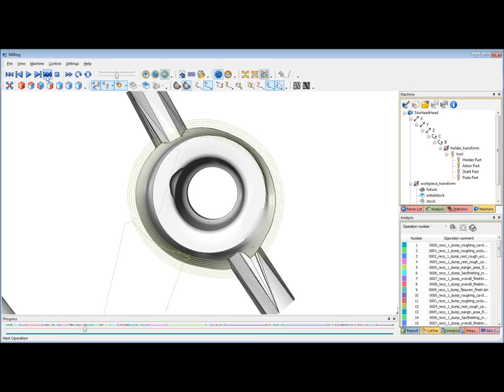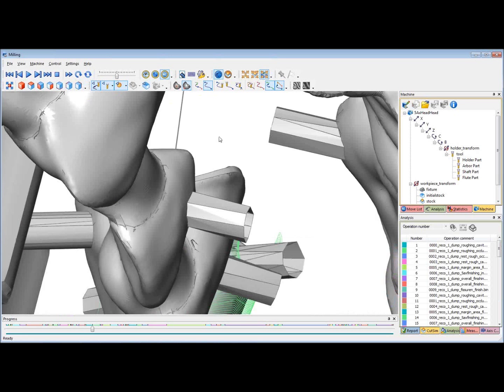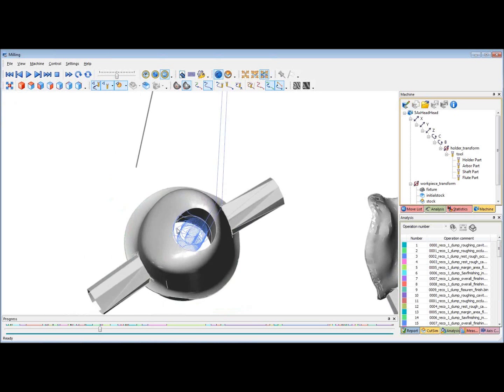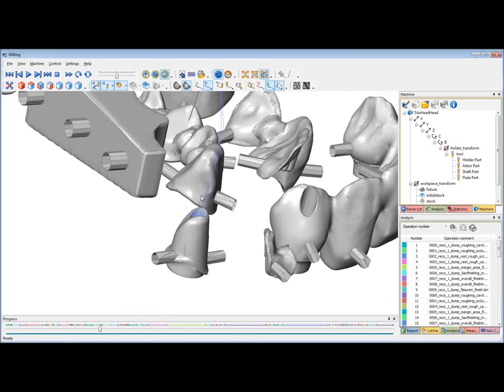We have some finishing cycles for the screw hole and then finishing outside. Again, we have overall finishing on the occlusal side here with the cap screw hole, and then 3+2 axis roughing of the screw hole.